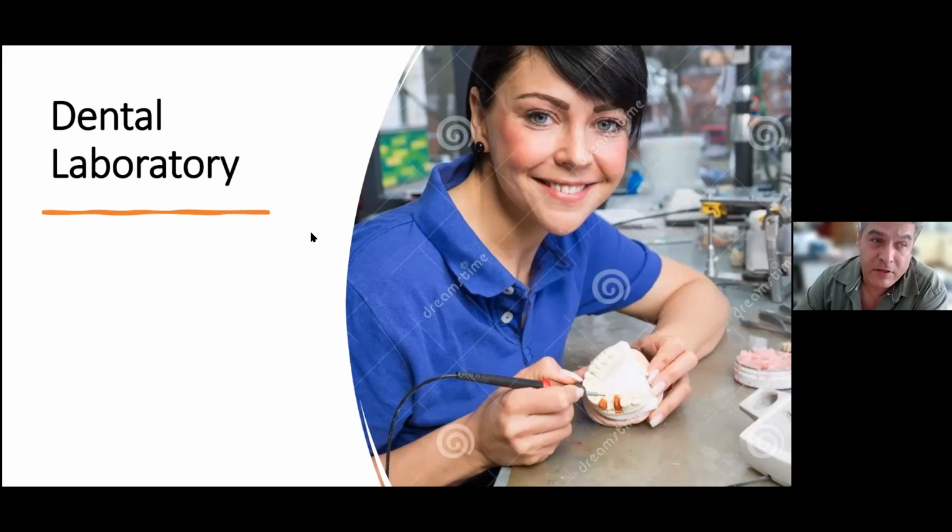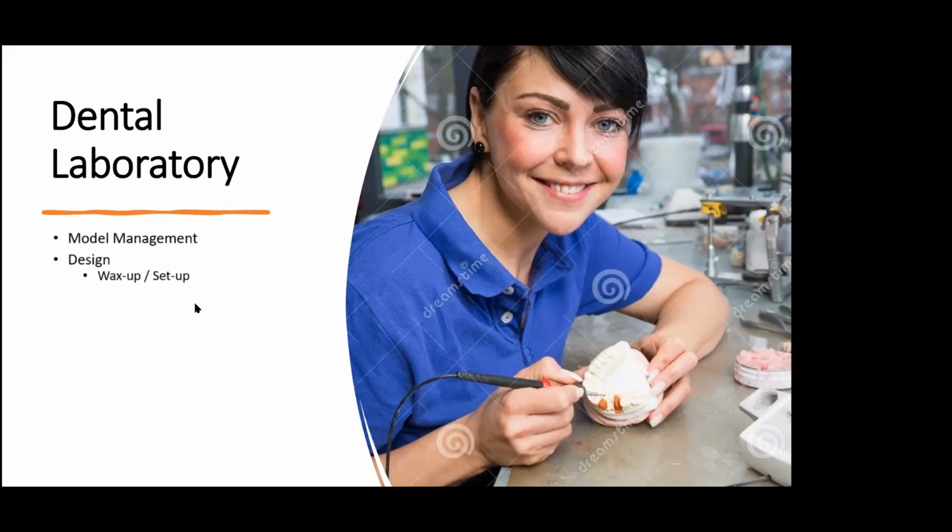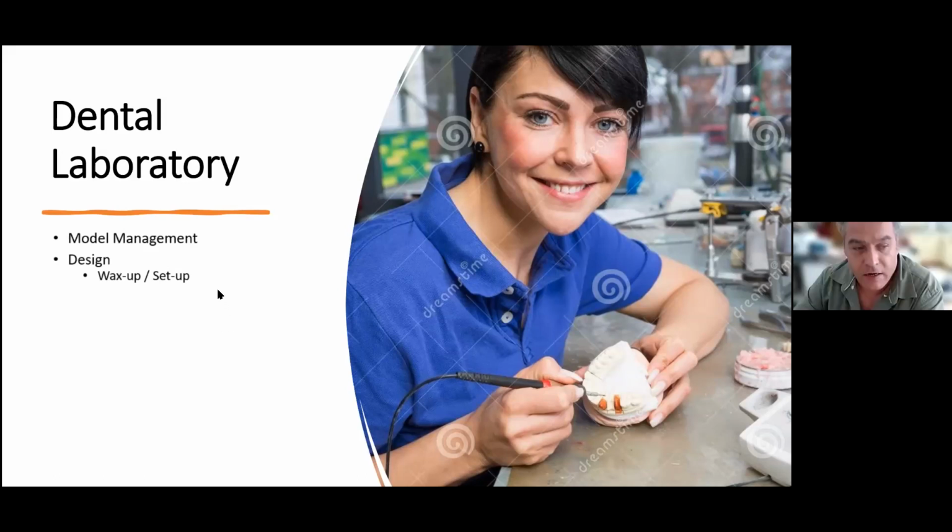After that comes the dental laboratory part. We have model management. We have our designing part. We do a wax-up, or for a denture, for example, a setup. And after that we have the manufacturing part, that's casting, packing, pouring, or maybe pressing. It depends on what type of restoration we want to do.